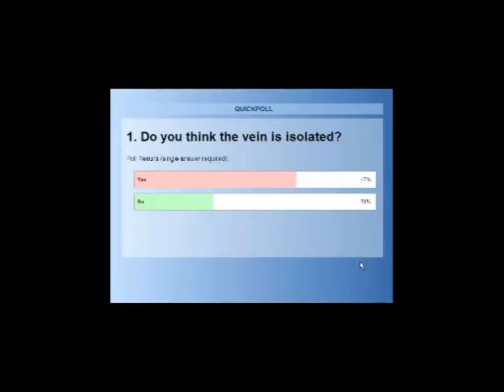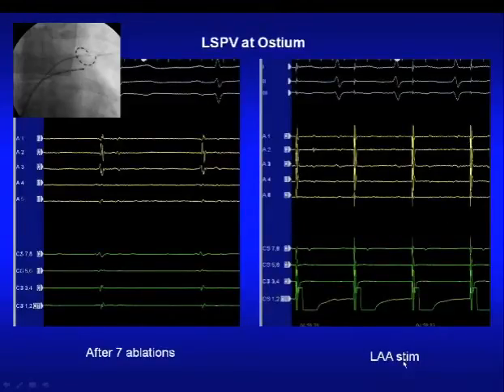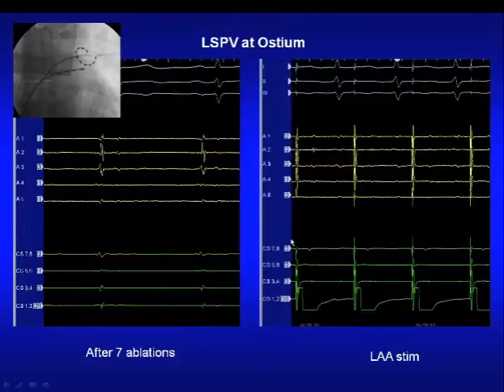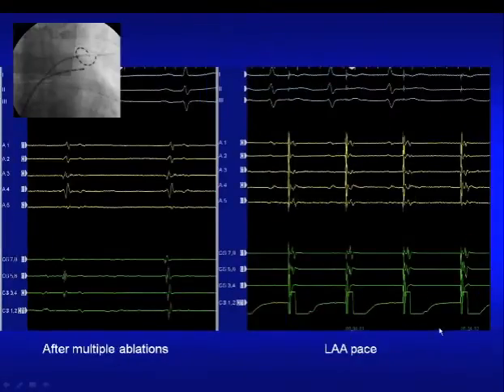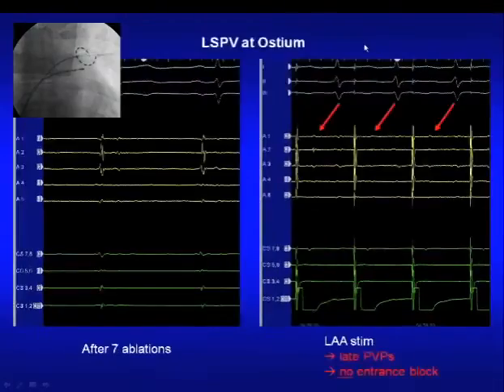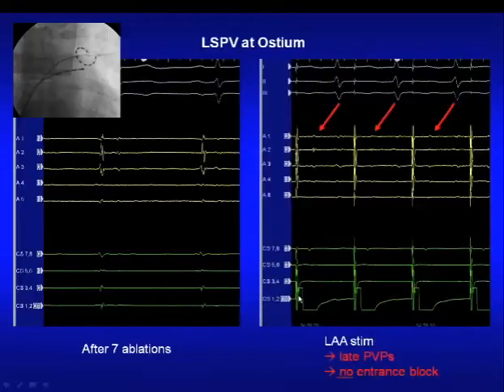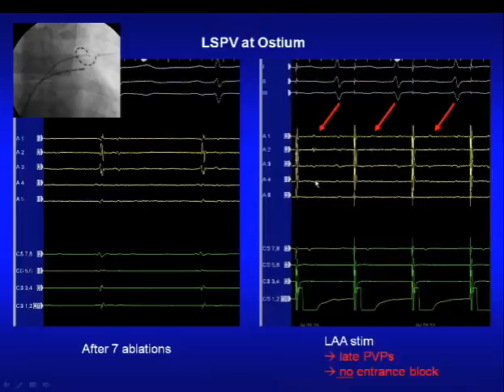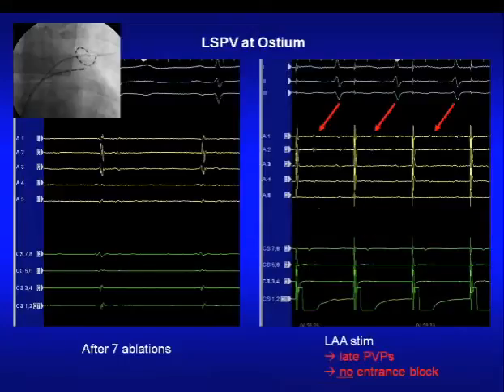Most of you thought the vein was isolated, but let me show what actually happened. During pacing of the left atrial appendage, most of the signal is pulled in close to the pacing spike. However, there is a small delayed sharp component — a tiny but real pulmonary vein potential — indicating that entrance block has not been created, and exit block has not yet been tested. The vein is not isolated.